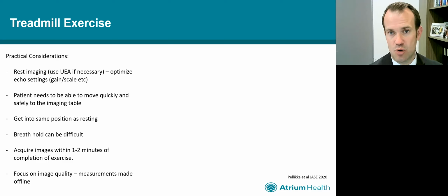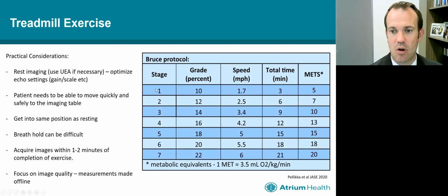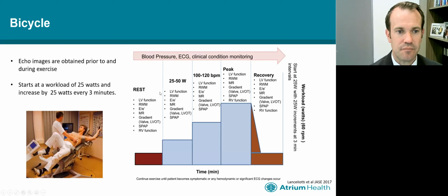The most common protocol that we use is the Bruce protocol. This is a stage protocol where we're increasing gradient and speed at set intervals. But it may not be the best protocol for many individuals. And so I would encourage you to be flexible in what type of protocol you're running, and having a very good and strong exercise physiologist can help there.